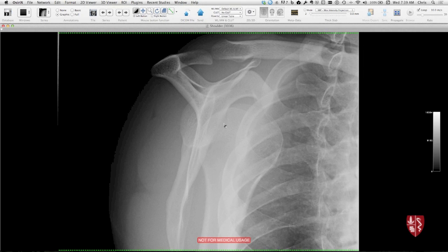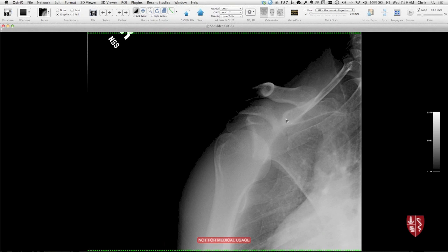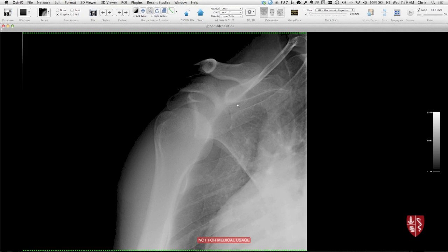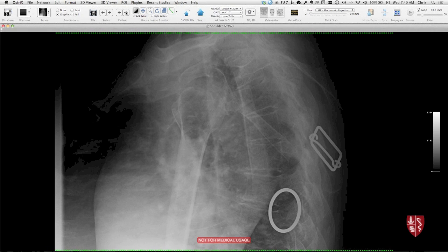So if you look at a Y view in that case — scapular spine, coracoid base here, scapular body — the glenoid is right in here. The chest is always going to be anterior to the scapula on this view, so you can tell the humeral head is anteroinferior displaced relative to the clavicle. This is the Grashey view in this case, and you can see there's abnormal overlap between the humeral head here and the glenoid.